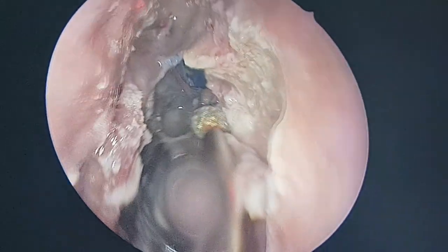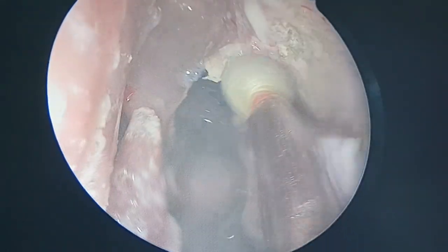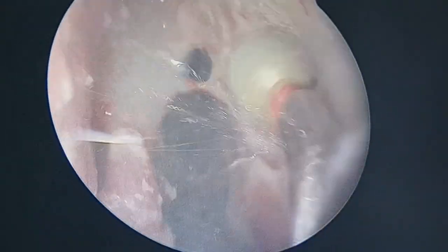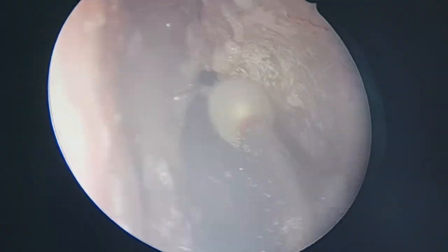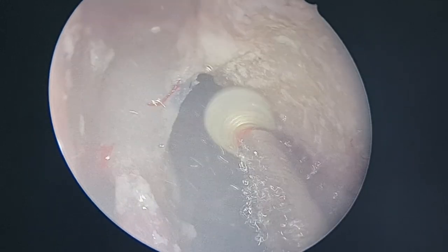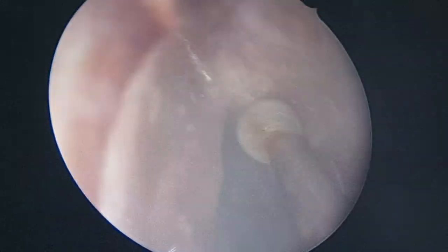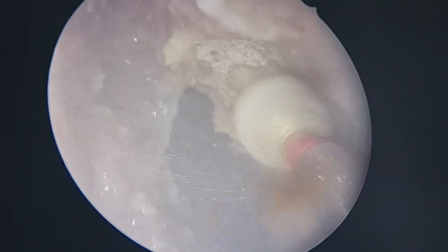So you have to first define your lateral limit so you don't transgress it, number one. And then keep going anteriorly. Keep going anteriorly. See, I am working with a 0 degree. The beauty of the draft procedure is, number one, you do the entire thing with a 0 degree. Number two, you work in the safest zone. No fear of damaging anything. Keep irrigating the telescope.